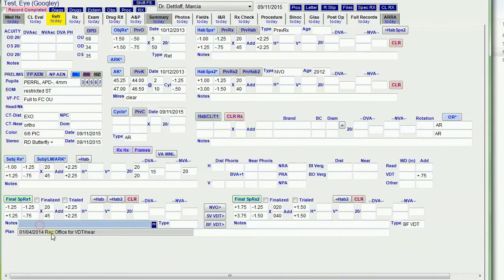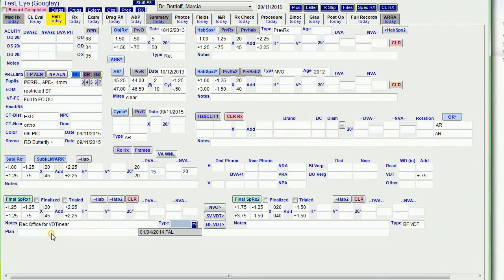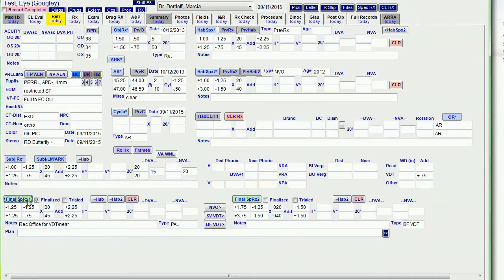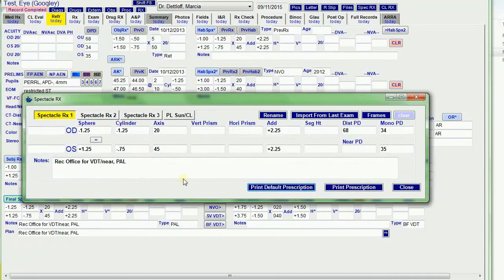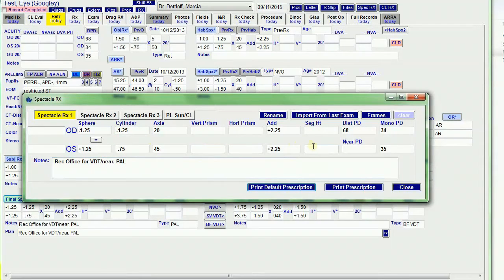Okay, so let's just copy these notes. I'm going to put recommend office for near and PAL. And when I finalize it, it's going to check the finalize box. It opens up the window so I can confirm that the prescription is in there.